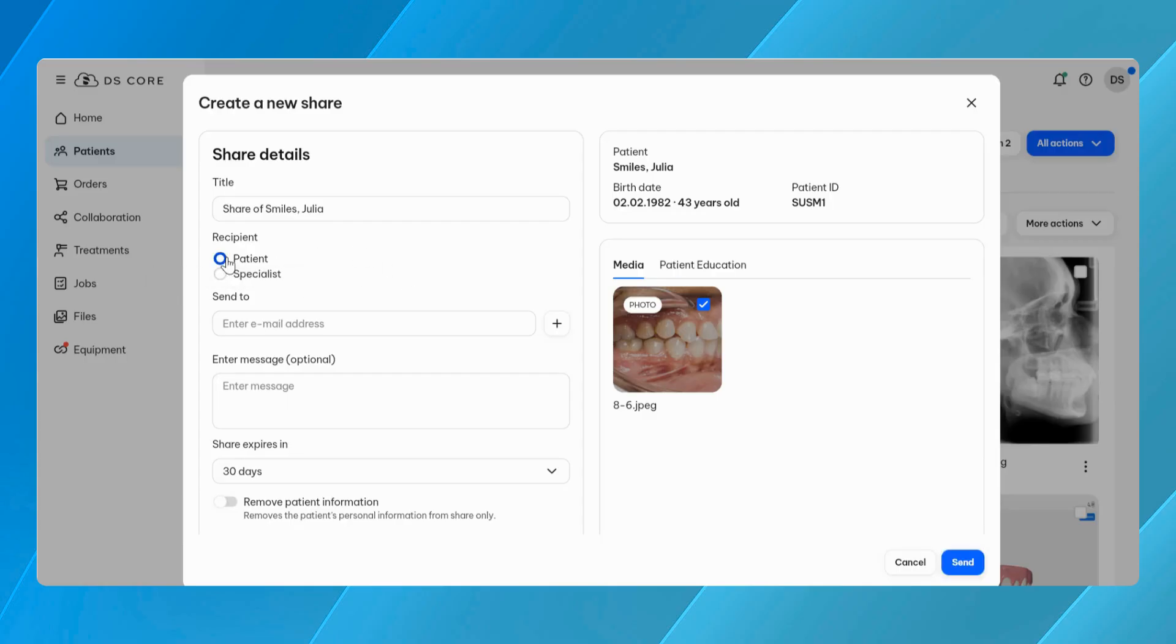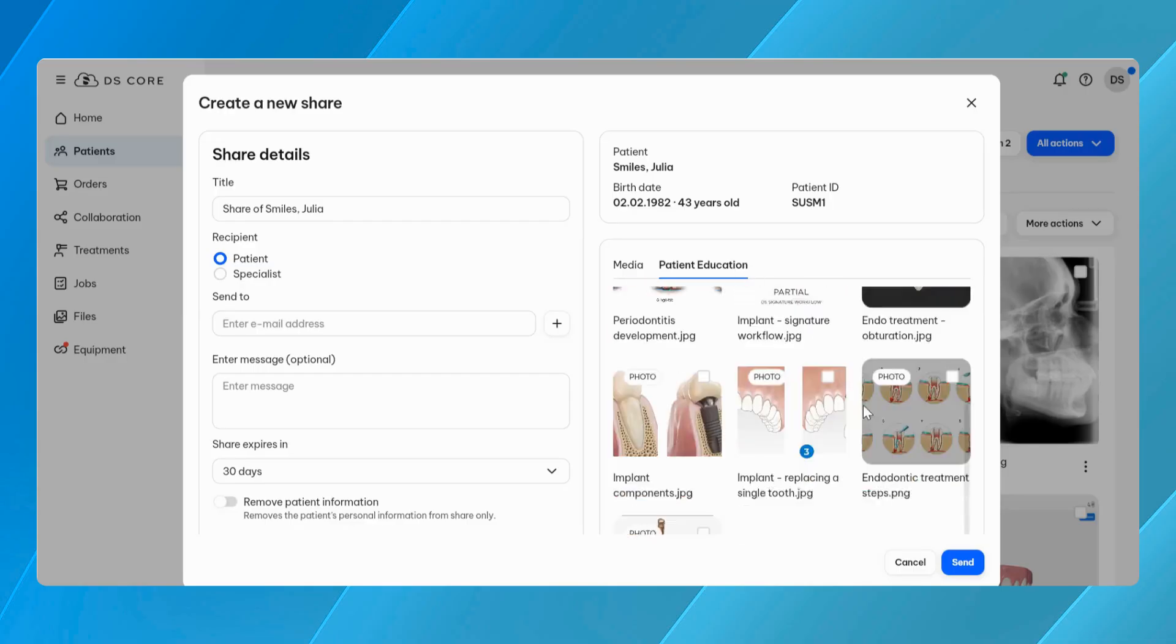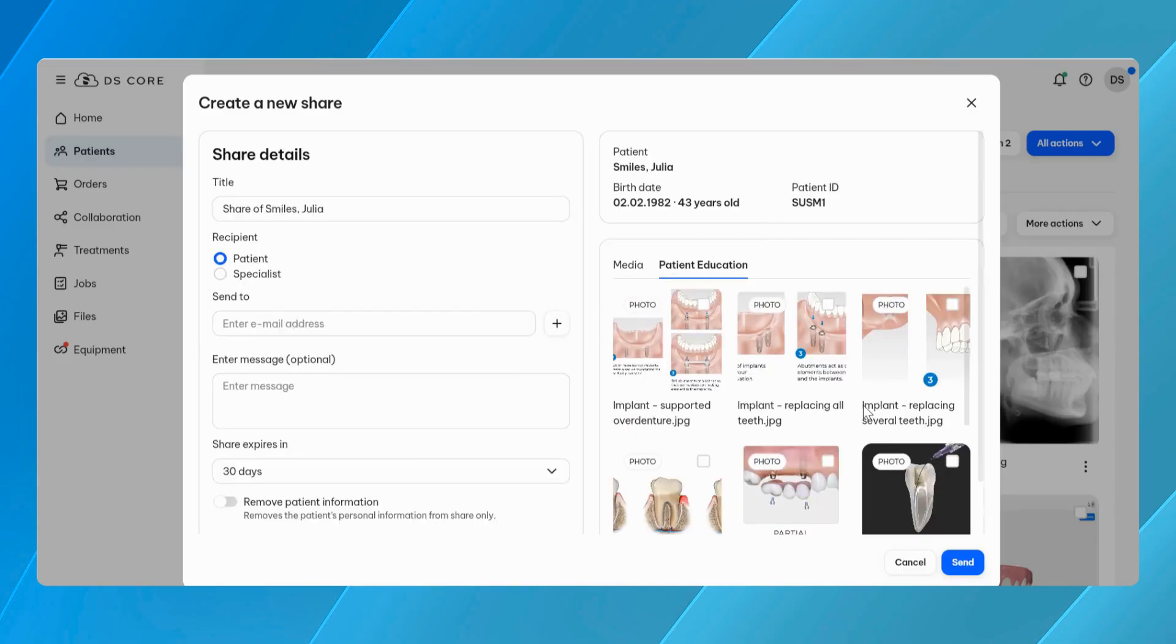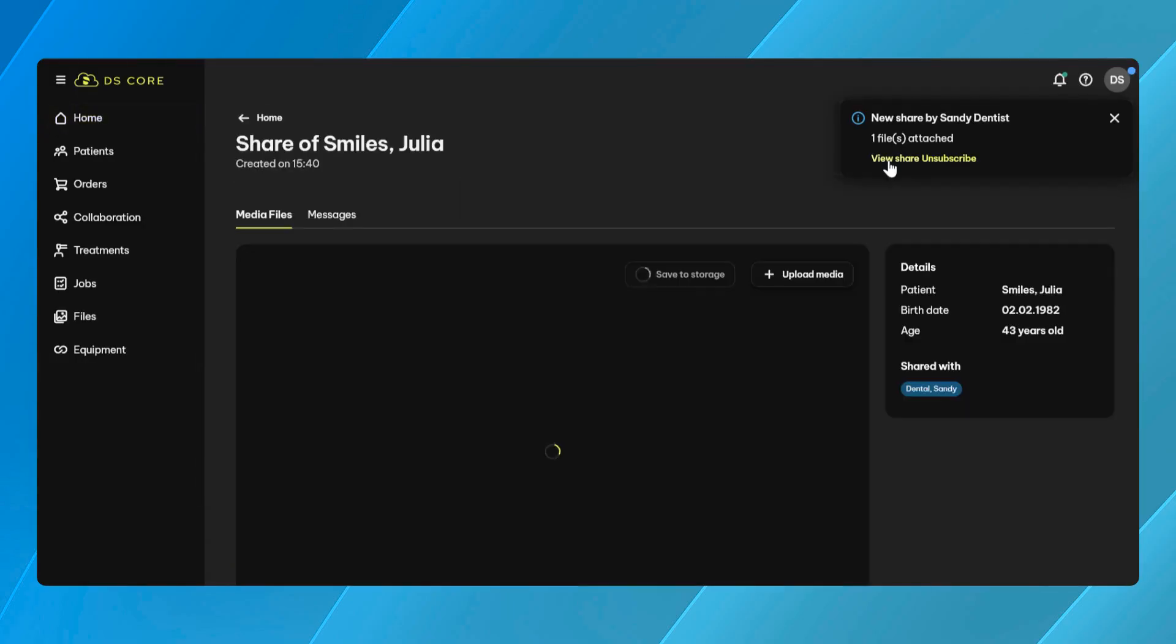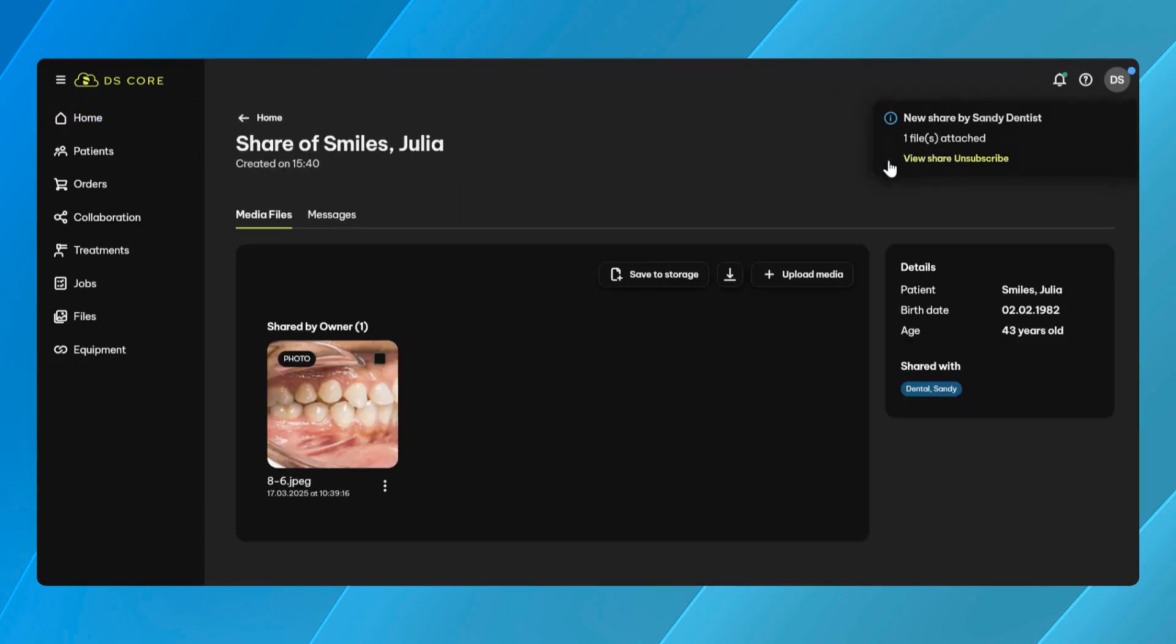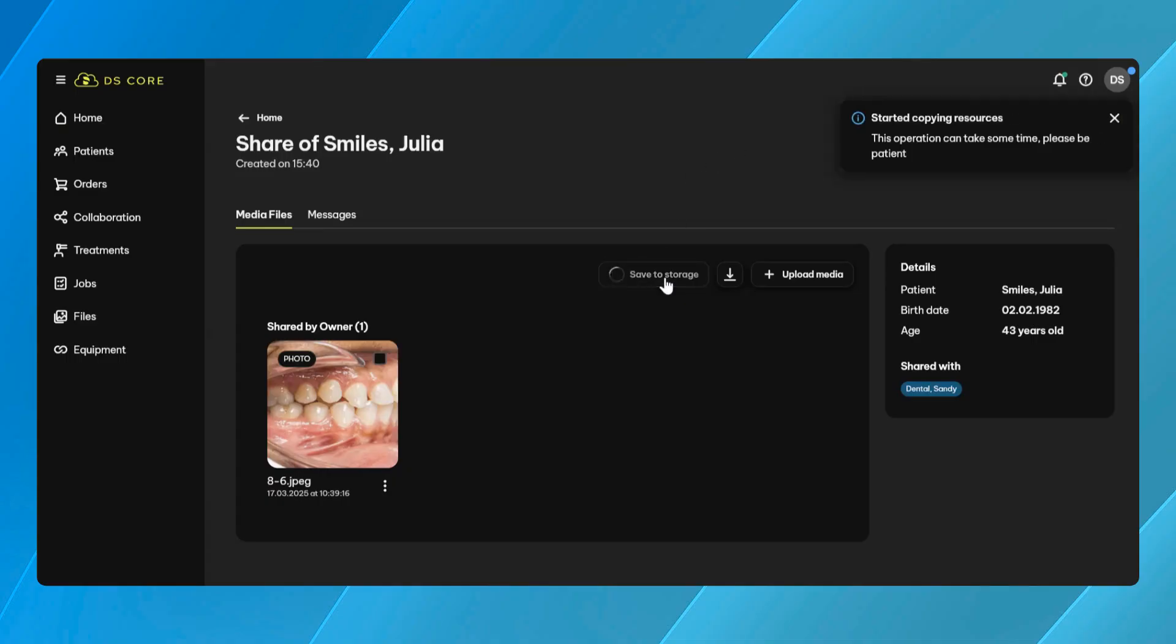In earlier versions, sharing with patients was only possible from Canvas, while sharing with clinicians was limited to the Media Library. The new sharing dialogue simplifies this by allowing you to select the recipient type, either patient or specialist, directly within the same interface.